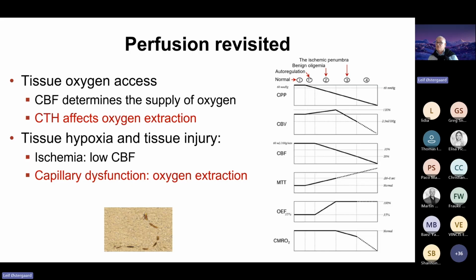So it's important that we are getting more of the full picture, as the one you see on the right, where we began with thinking of the hemodynamics, the blood flow in stroke, to now also look at what is oxygen extraction and what is the CMRO2 that cells essentially can produce or have in the tissue given the hemodynamics we see.